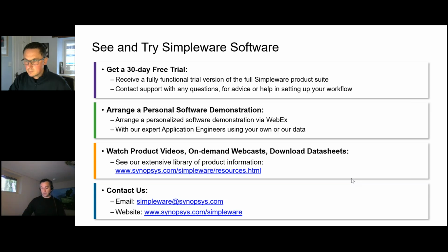What we'll do is a prototype free of charge, where the customer sends us about 10 data sets from what they're expecting to need to segment, segmented and landmarked as a ground truth. We'll train a small model, and then we'll ask them to send us an 11th or 12th data set, and we'll run those through it just to show a proof of concept, just to show that it works.